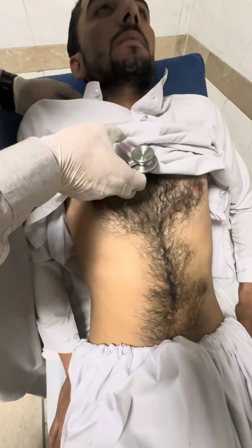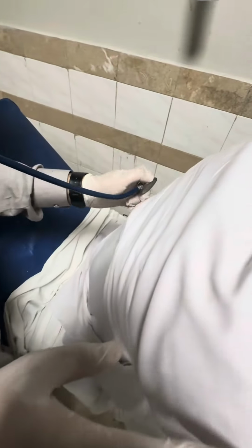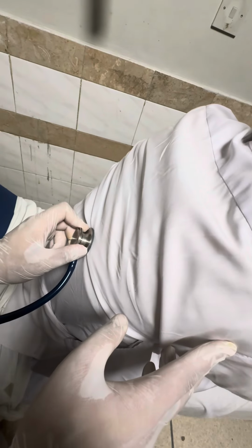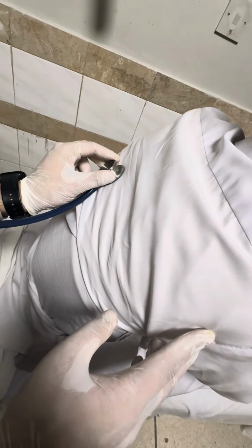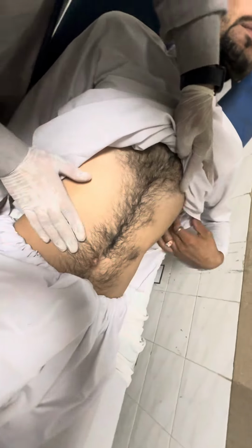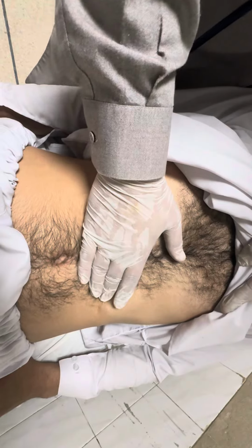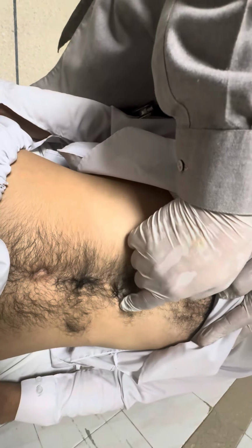At the end, we will ask the patient to sit down, and we will auscultate the base of the lung for crepitations. Like in heart failure, there will be pulmonary edema, and we will auscultate the crackles in the lungs. At the end, we can also palpate the spleen in order to rule out infective endocarditis in a young patient presenting with a new murmur.